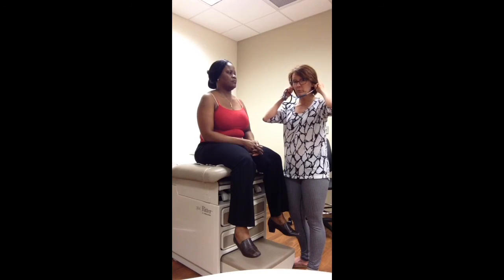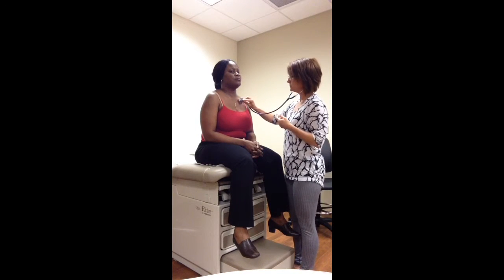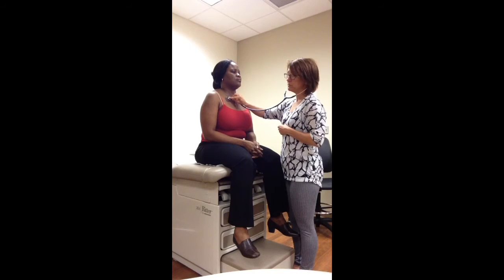So when we percussed, it all sounded good, and so now we're just going to have her take some more deep breaths for us so that we can listen to the upper lobes. And again, you're going to want to be comparing both sides, inspiration and expiration.